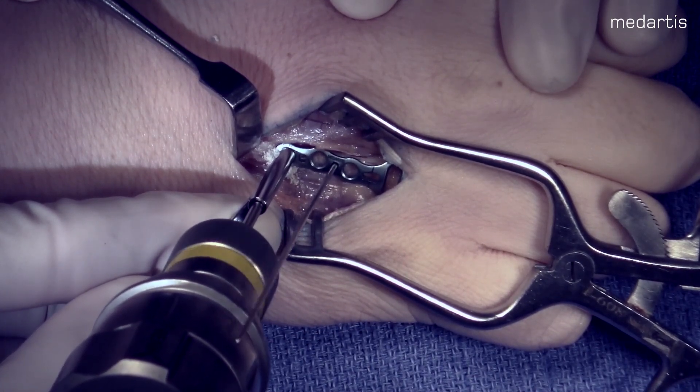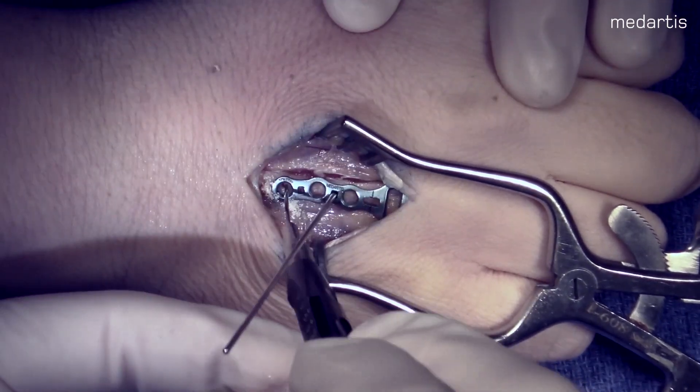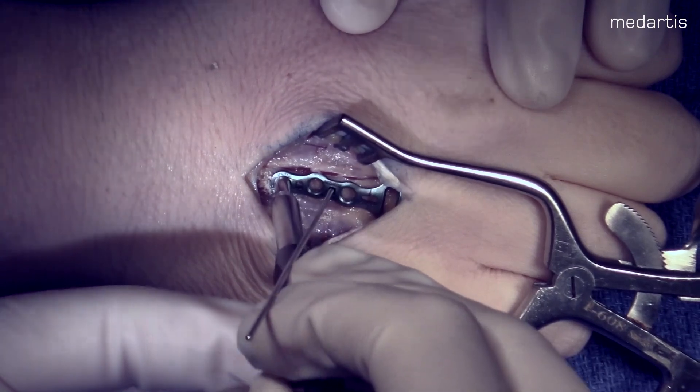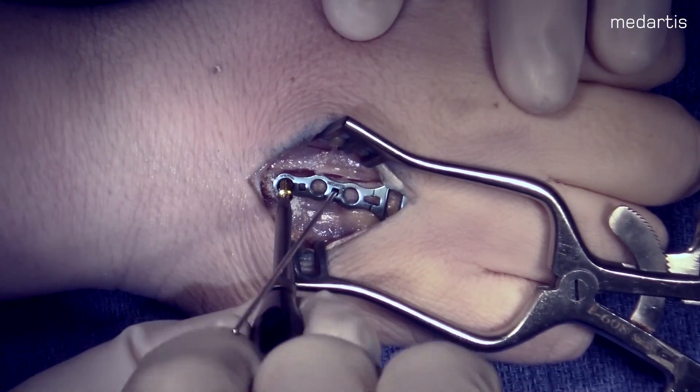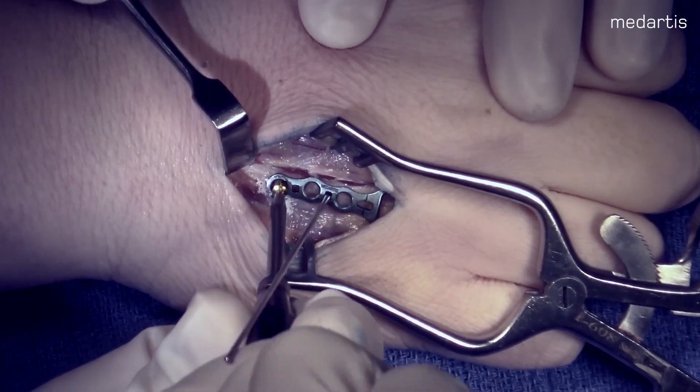Here you can see we are drilling our proximal screw. We will measure with the depth gauge. Here we measured an 8 and we will use a gold screw for a cortical screw. The blue screws are locking screws.